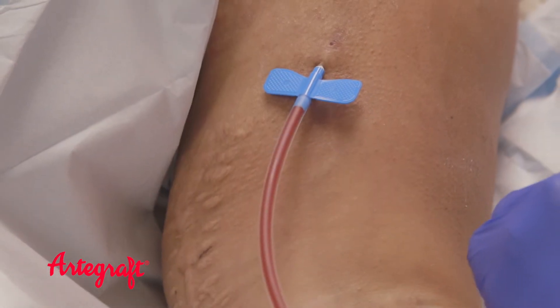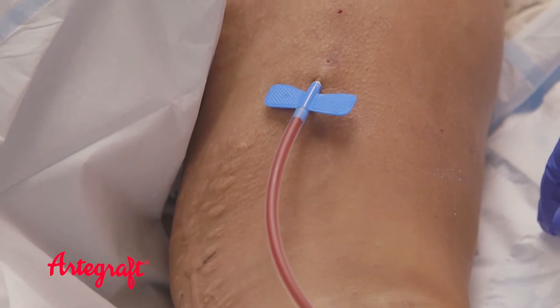Typically, the first cannulation is done with a 17 gauge needle and over time enlarged to a 15 gauge needle.